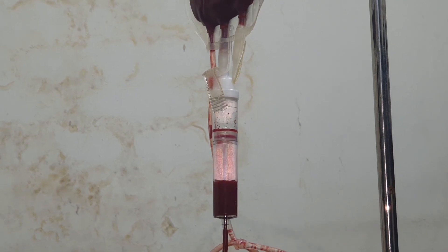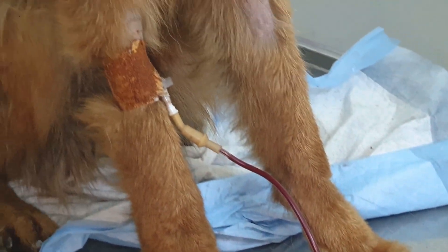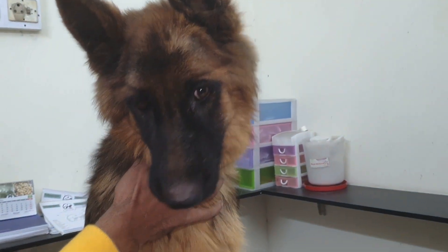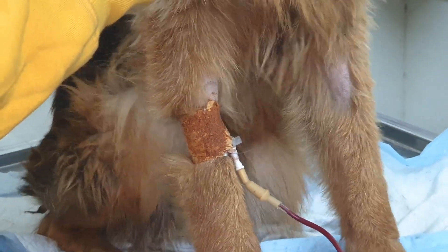As you can see in the video, the blood bag is placed above the level of the dog and the recipient dog's IV line is already maintained. We simply place the pipe into the IV catheter and it's ready to go. Thank you so much for watching — stay tuned for more videos, and do let me know in the comments what kind of videos you'd like to see.